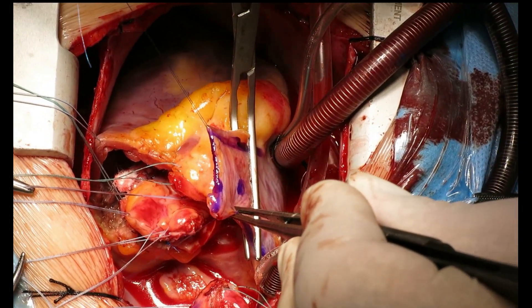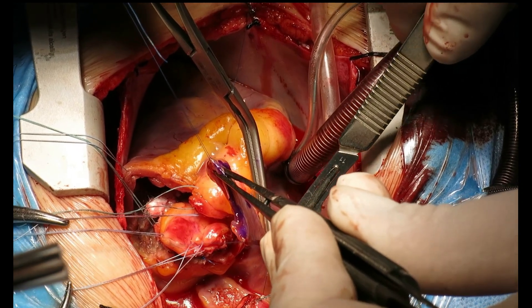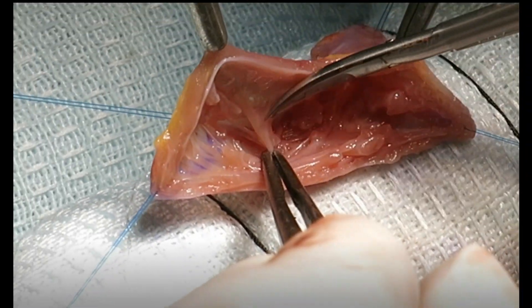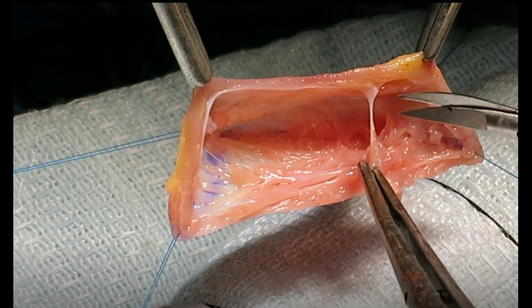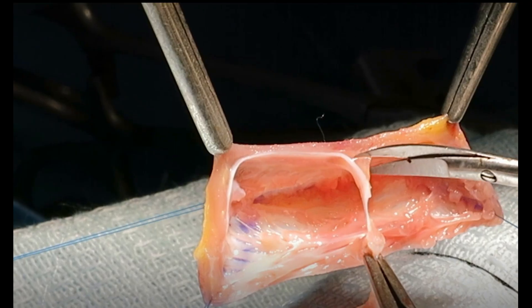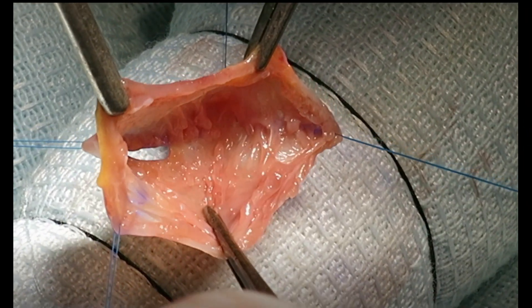The appendage borders are marked, leaving the medial wall a few millimeters wider than the lateral wall. The appendage is cut over a cross clamp and removed from its base. To prepare the appendage, the four corner sutures are stretched, the wall is lifted sequentially, and large muscle bands inside the appendage are excised. We have learned that the medial wall should become thinner to compensate for the greater flexibility of the lateral wall. The distal end is then opened to change it to a tube.